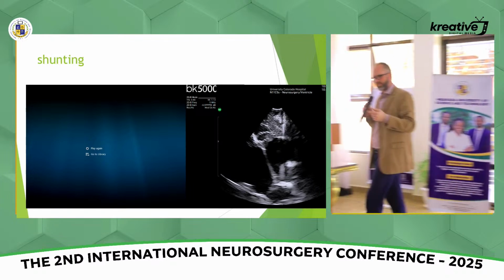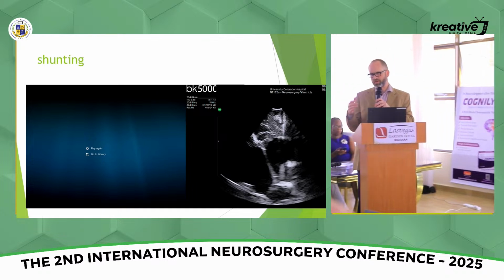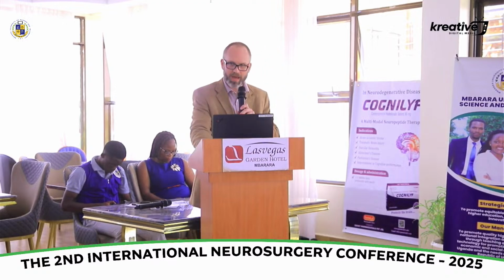Although the metal artifact you could see very well with the stylet when it went in, this is just meant to show you that if you have a small probe, like a burr hole probe, you can easily access the ventricles. At surgery, if you have hydrocephalus because you've obstructed and you have a lot of brain herniation, this can help nicely guide you in to drain the ventricle, especially if you're in a non-anatomic position.